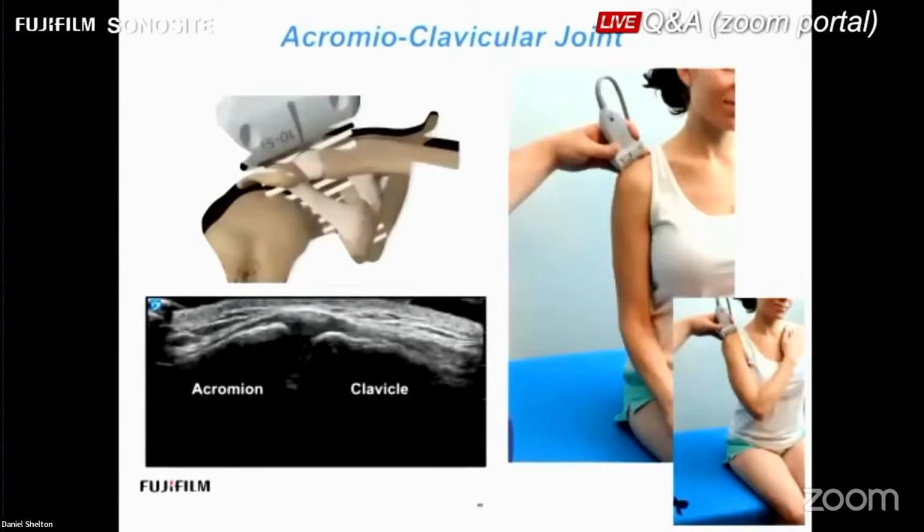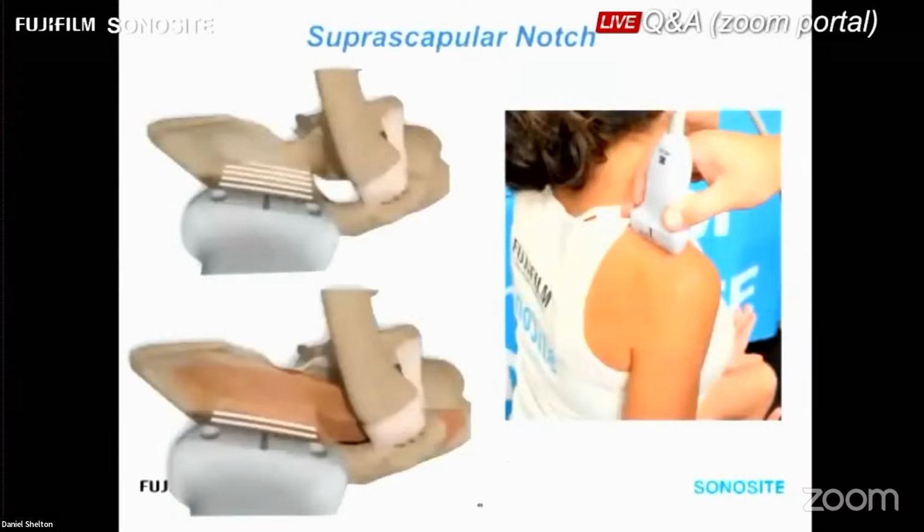I'm going to move on to the suprascapular notch. This was a really fun structure to learn, and once I had it taught to me, it was one of those things that you can't unsee. While you're in the area, you might as well plop the probe 2 or 3 centimeters midline, aim the beam anteriorly and see what you can see, and look at the supraspinatus muscle, which we discussed in the lateral shoulder webinar and the posterior shoulder webinar, for atrophy. But if you have not explored the anatomy of the supraspinatus fossa down at the bony surface, this is a great time to learn that landmark.